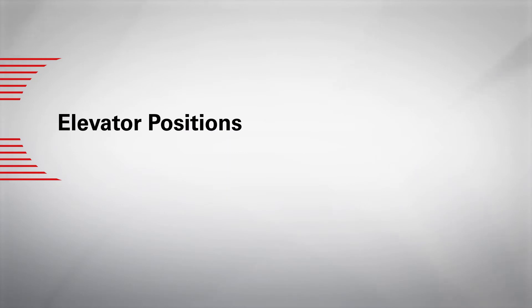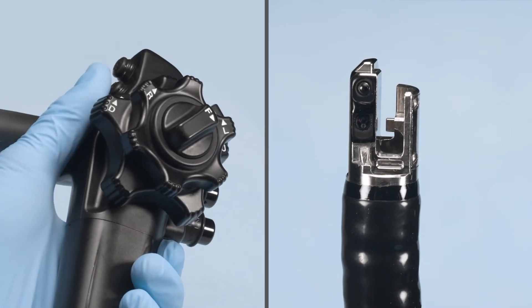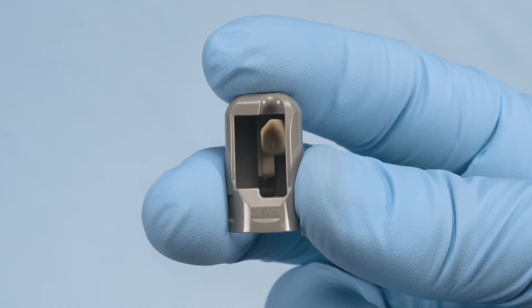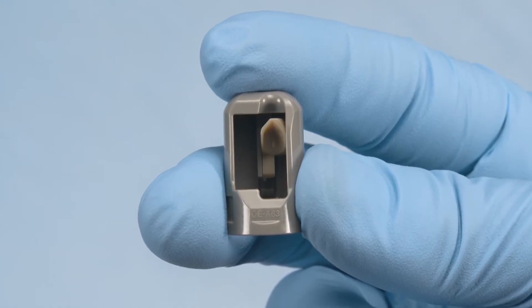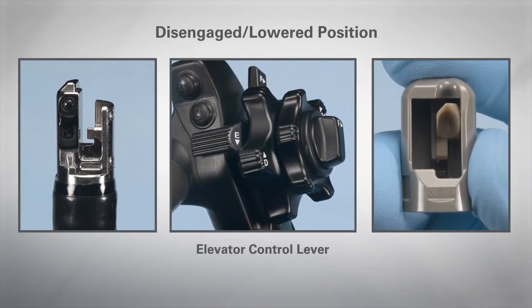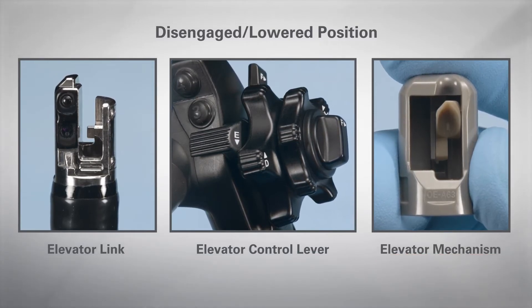It is important to ensure the elevator link and elevator mechanism are in the correct position when properly attaching the elevator cap to the distal end of the endoscope. In the disengaged or lowered position, the elevator control lever is pushed proximally until it stops. The elevator link of the endoscope will be parallel to the objective lens, and the elevator mechanism of the elevator cap will be parallel to the opening.